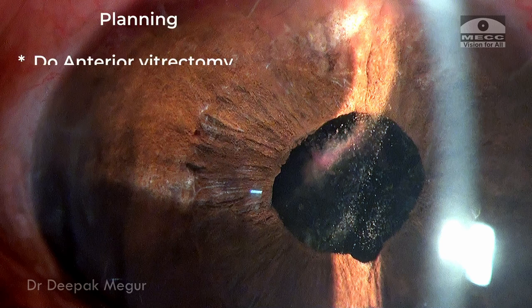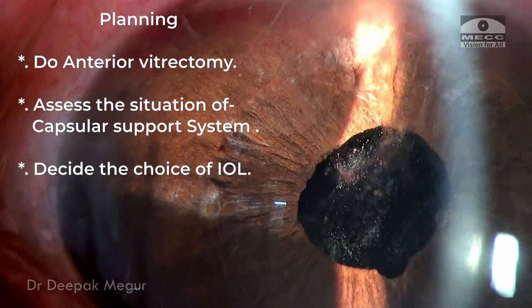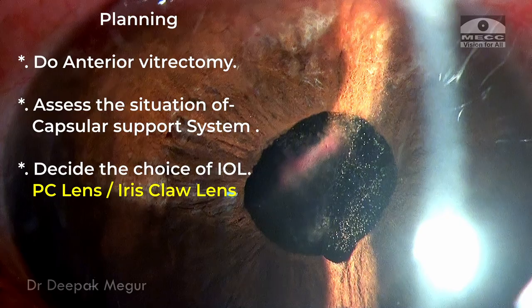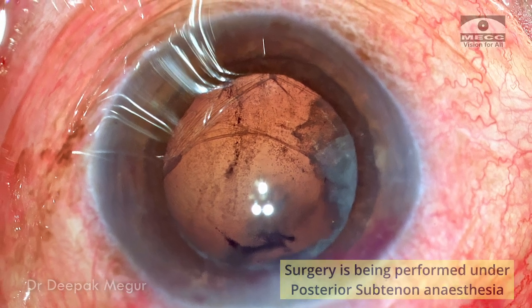The plan is to do an anterior vitrectomy, then assess the situation of the capsular support system and decide on the choice of intraocular lens — whether to go with a posterior chamber lens in the sulcus or an iris claw lens. The surgery is being performed under posterior subtenon anesthesia.